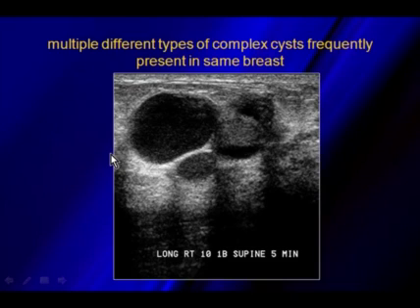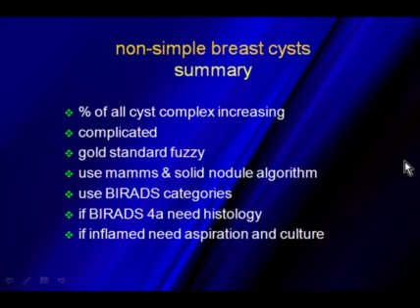In looking at the different types of cysts, this was taking one image of a patient with multiple breast cysts. In fact, everywhere you scanned in the breast, you would see cysts or lesions that look just like this. We have ones that appeared to be a fluid debris level. We have ones that appear to be foam or gel cysts. Here we have these acorn cysts. You can see some papillary apocrine metaplasia here. All far too many to aspirate all the time.